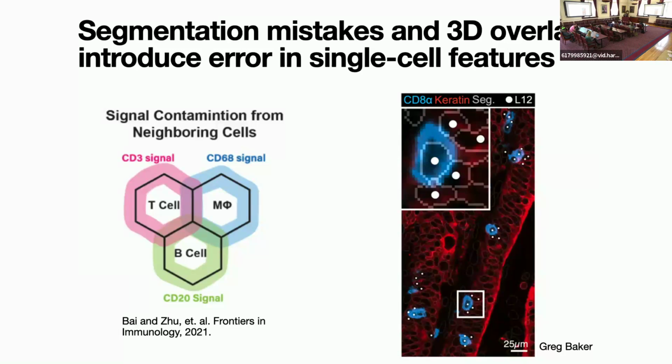The ramifications of this have been noticed by people in the past, and there's an algorithm called RedSea that was posted a while ago that purported to fix this in already captured images. We tried it, and it doesn't work very well. I kind of don't know how it could, but on the right, you can see a representation of what this would actually look like in a real image.